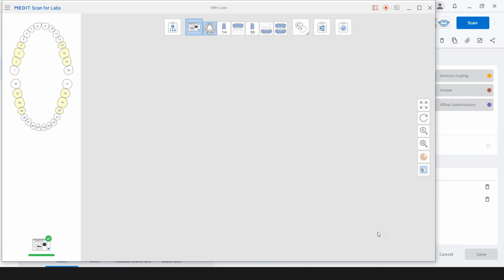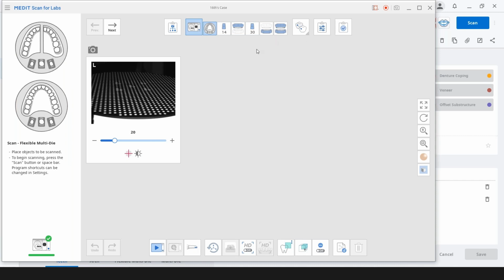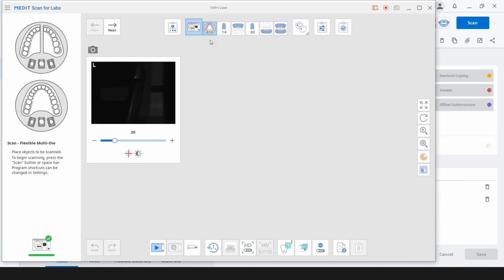Okay, so I'll confirm this. Now you see our work order here at the top. These icons are in a certain order, but that doesn't necessarily mean you have to follow that. Say I had this in the case pan and the models came to me articulated. I could just skip right to this icon here, do the occlusion scan, and then go back to the first step. The software is very intelligent. Like I said, it determines the steps that you need. It's not going to give you unnecessary icons that you don't need, to avoid confusion, and that helps because you're going to be clicking next, moving through the workflow.